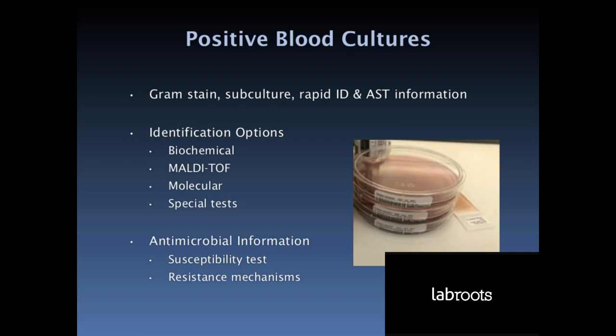Why do blood cultures? The physician wants to know the answers to 2 questions. Does my patient have a bloodstream infection? And if so, what do I treat with? This information is wanted quickly.